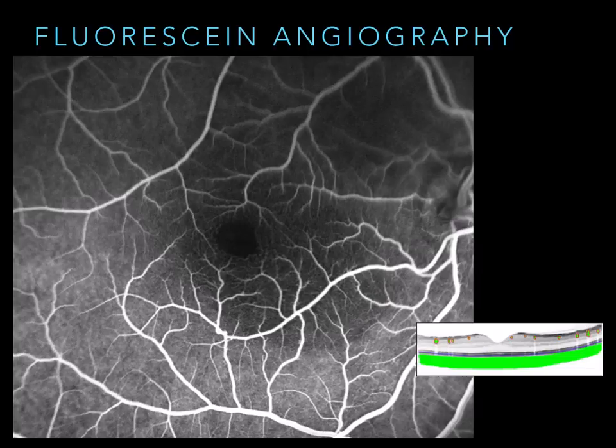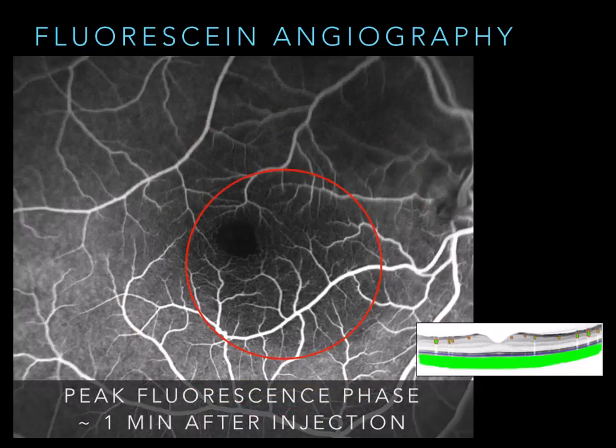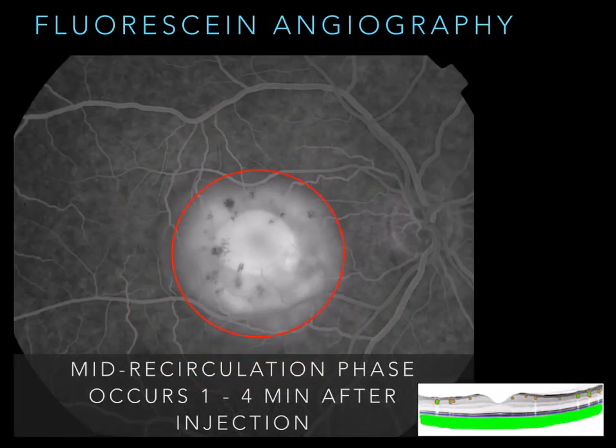There's a very thin subretinal fluid. It's a patient of mine with CSR. And let's go to the next one. All right, next. All right, and then again, it's hard to ignore the pathology. I should have changed the slide.